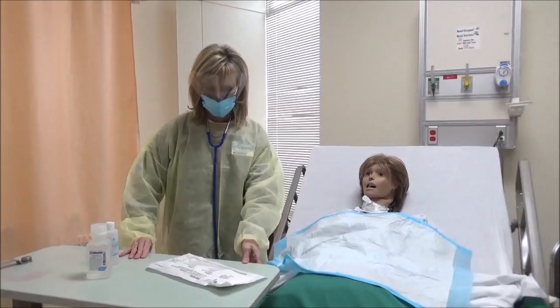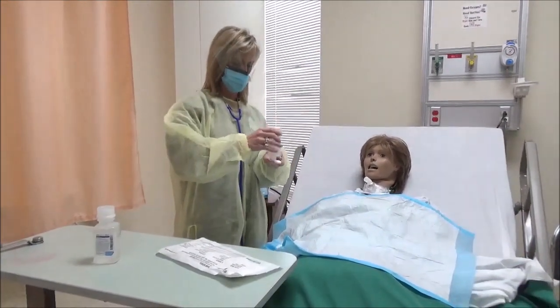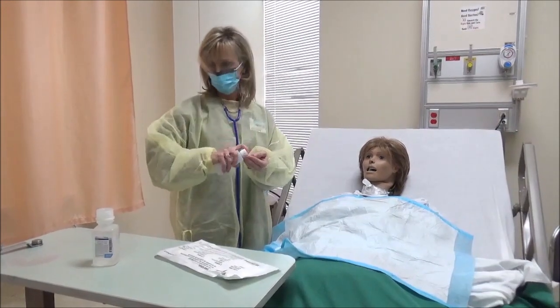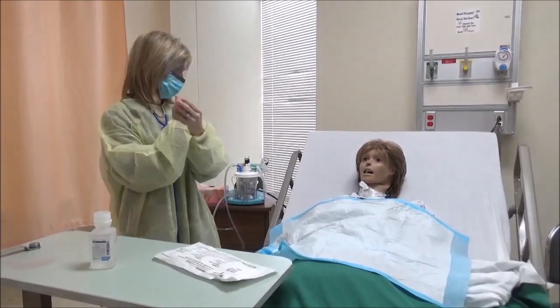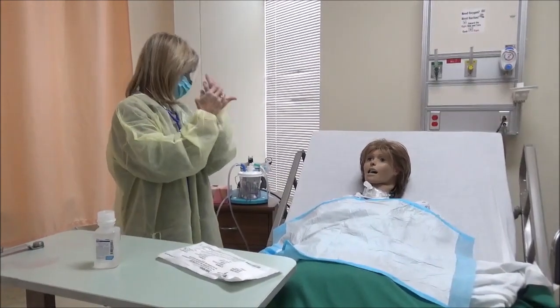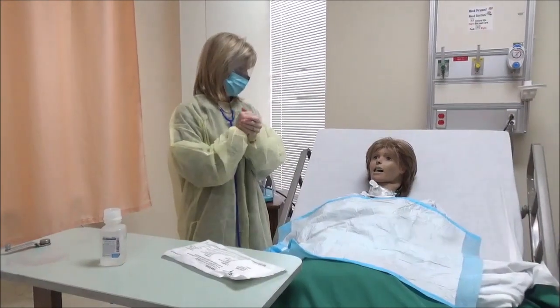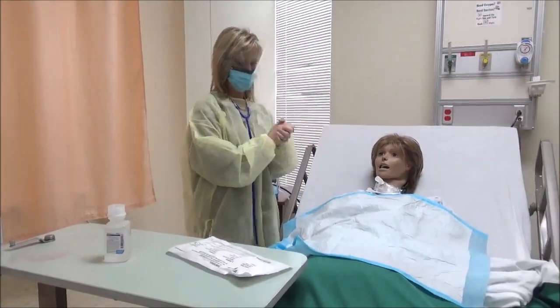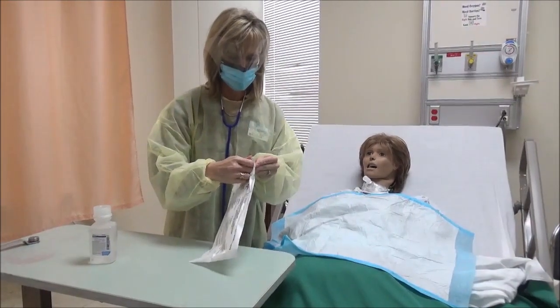Now as I go here, I'm going to make sure that I perform hand hygiene. And keeping a check on my client's O2 sat. And of course they got their trach collar. I'm going to open up my suction equipment.